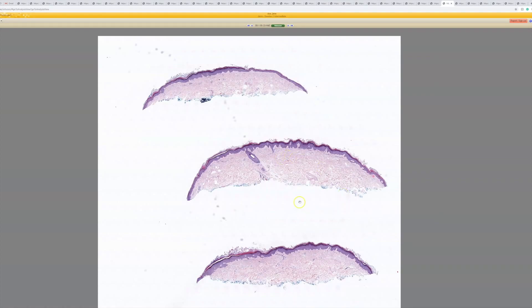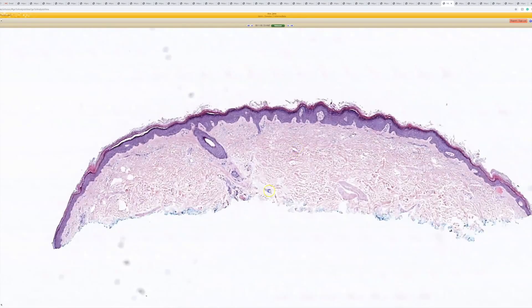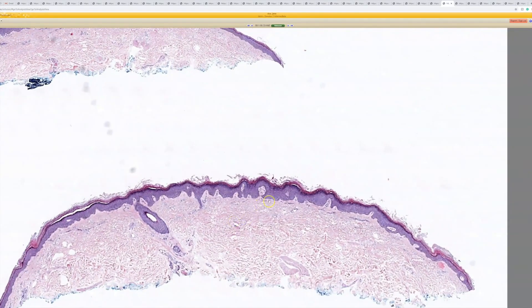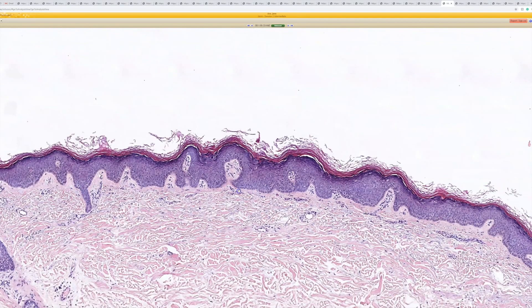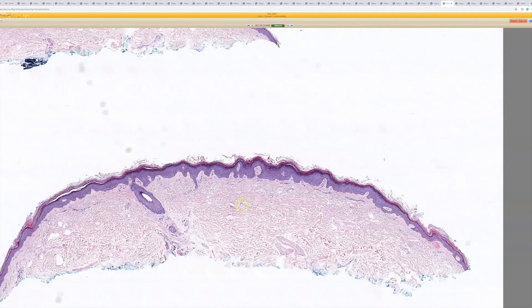This kind of looks like normal skin at low power, but closer in, there are some features of a wart. I think this is Verruca Plana. This is a very subtle lesion that from low power doesn't stand out as much.